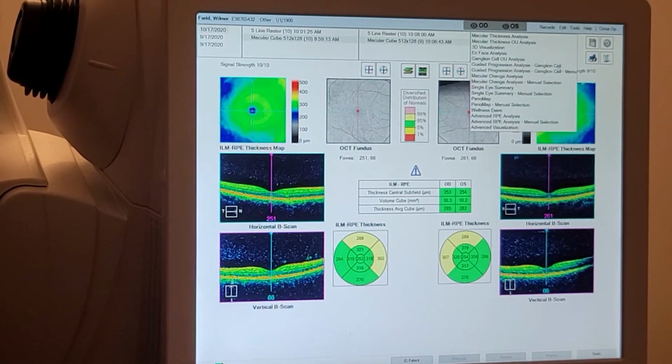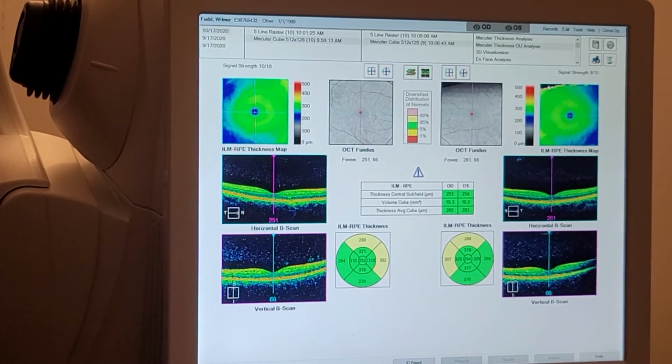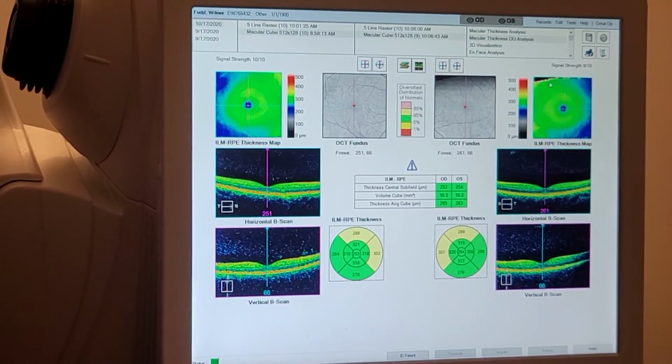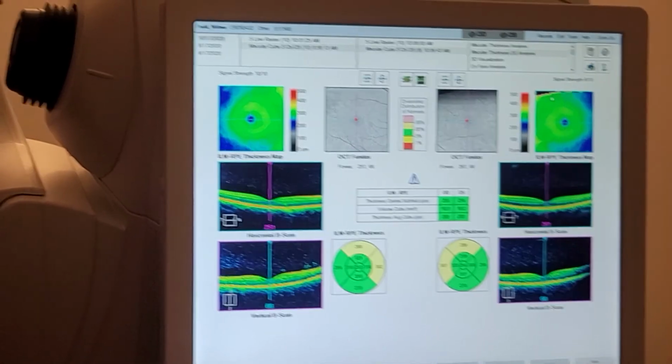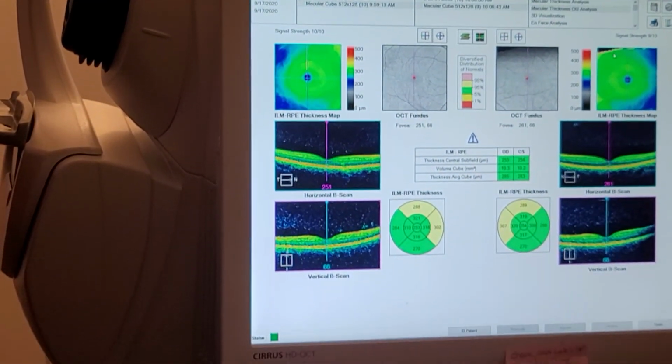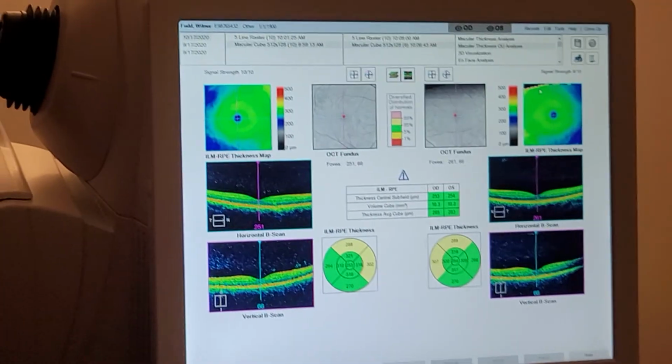But he didn't have that. It was just that I needed him to open up his eye a little bit wider. That's my fault as a technician. His eye is great. It's perfect. You have wonderful, beautiful eyes. No, I mean, healthy eyes.